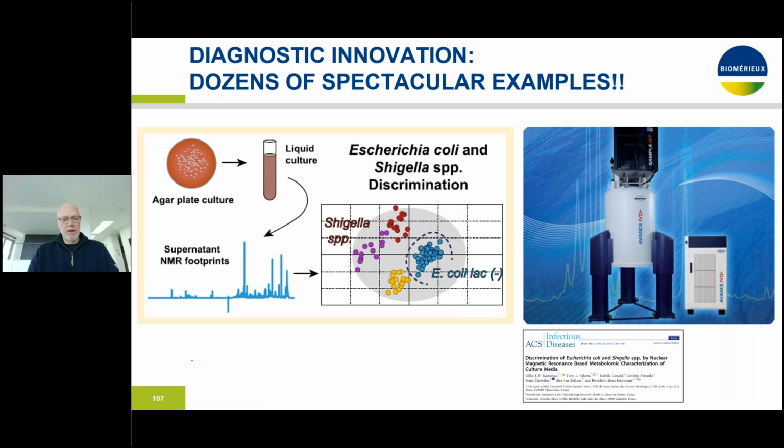but also for the detection of resistance genes, there is next generation sequencing, which using the Oxford Nanopore technology, for instance, can also be done in an hour with numbers of DNA molecules that are relatively low. So with a higher sensitivity than mass spec has in this day and age. Again, PCR is more expensive than mass spec.